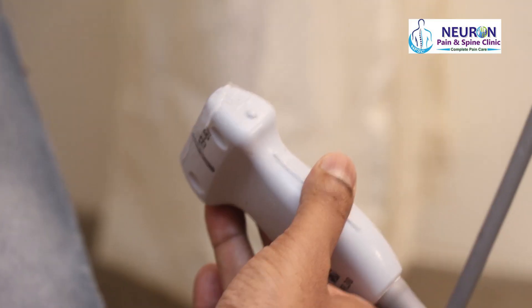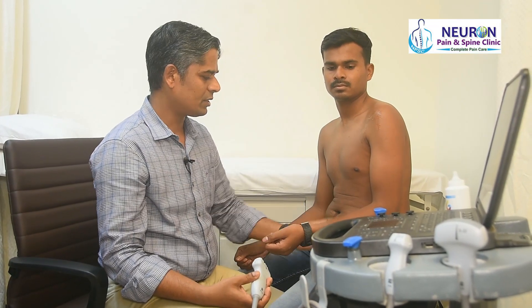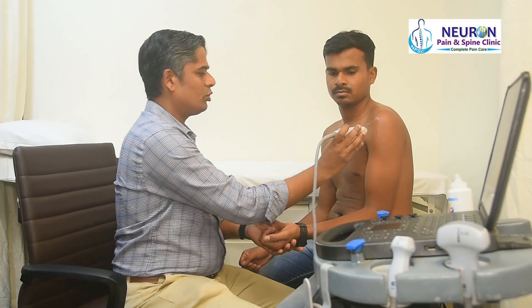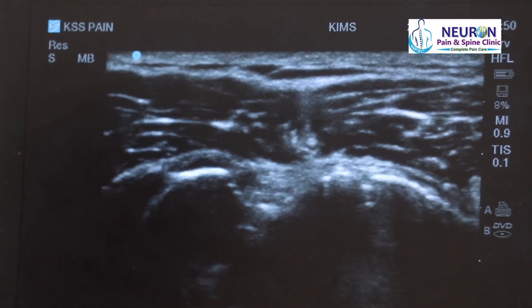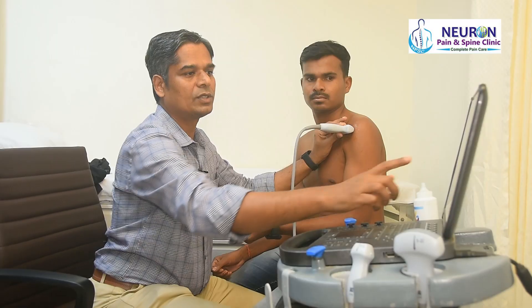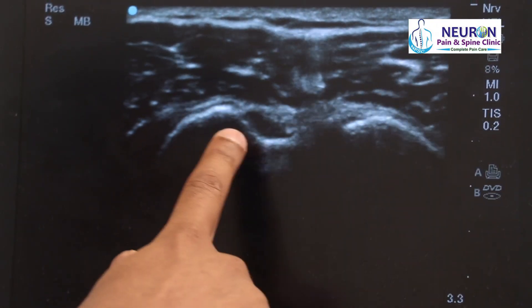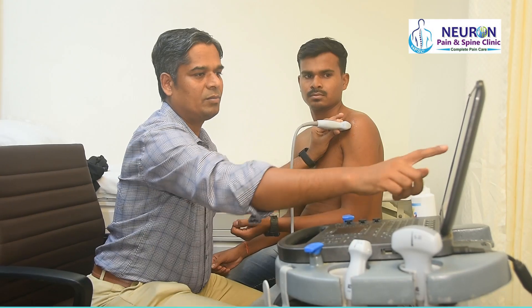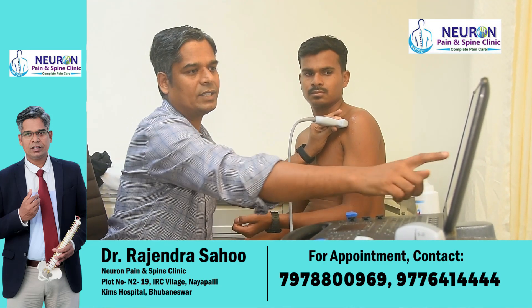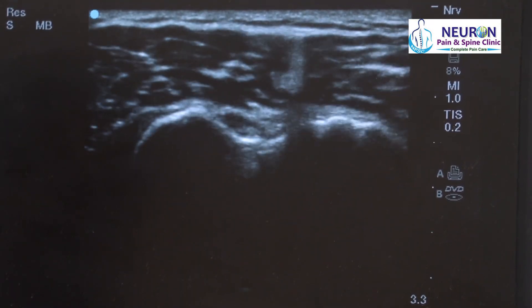Step one: the model is sitting comfortably in front of me, hugging the arm to the chest. Neutral position — slightly supinated and slightly externally rotated. In this image, the top is the deltoid muscle. There are two bony components: the medial one is the lesser tuberosity of the humerus — it has a sloping appearance with a subscapularis tendon attachment — and going further medial I can see the coracoid also. On the other side is the greater tuberosity.